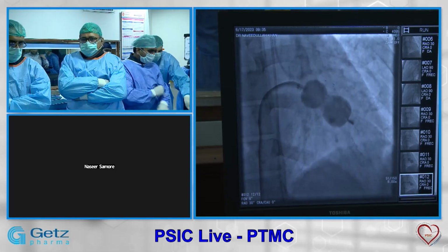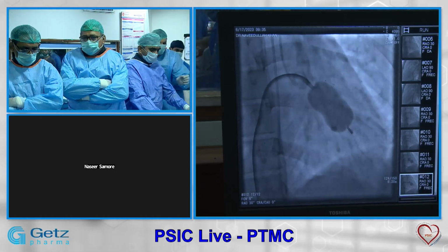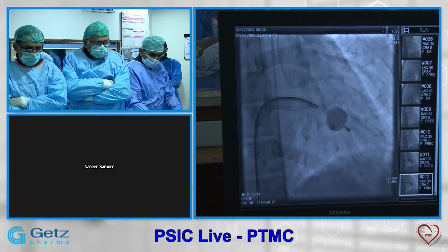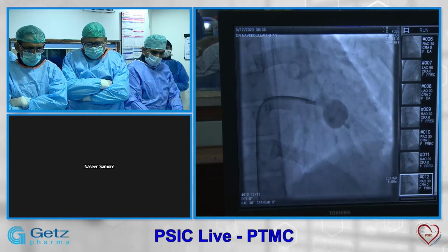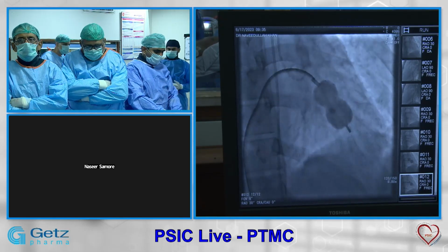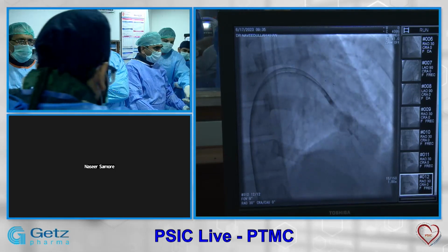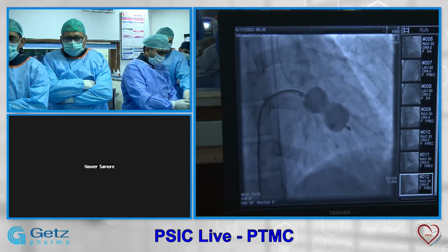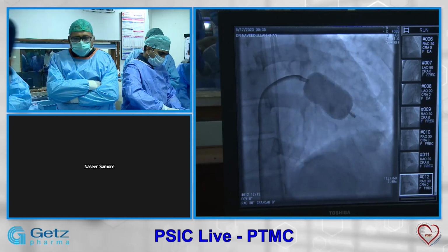And a few things, for example, at the entry point from the skin, once you are taking the balloon in, maybe you need to prepare the site to avoid any resistance for the entry, and then maybe make it at an angle of say 45 degrees.